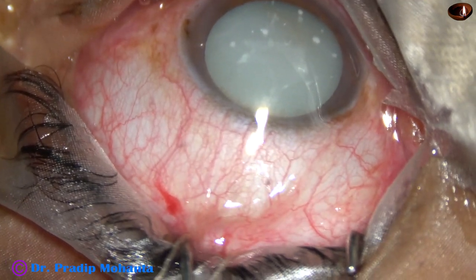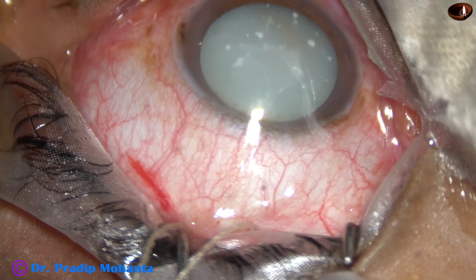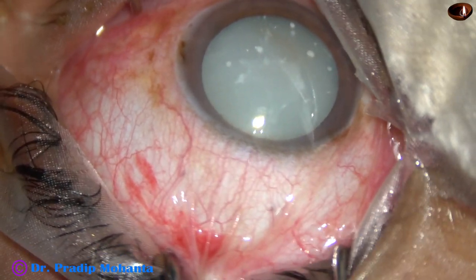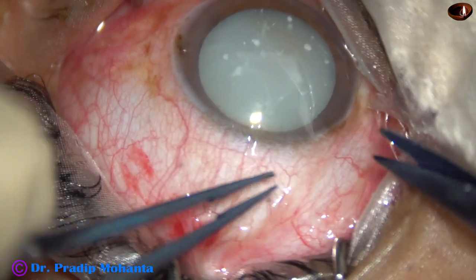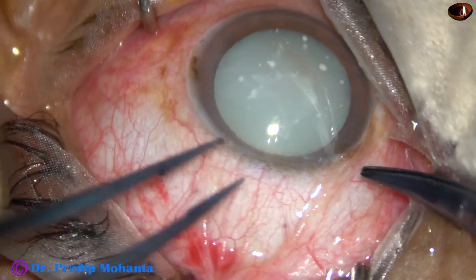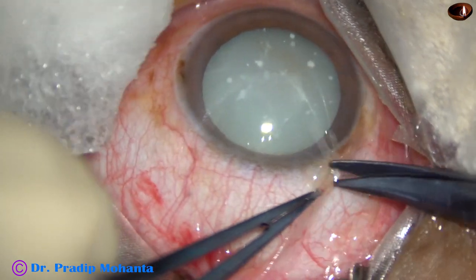And moreover, if we do phaco, there are a lot of risks in such cases: free floating nucleus, no epinuclear support, zonules can be weak. And in this case, we are going to see that the anterior capsule is fibrous. A lot of challenges are there in phacoemulsification.